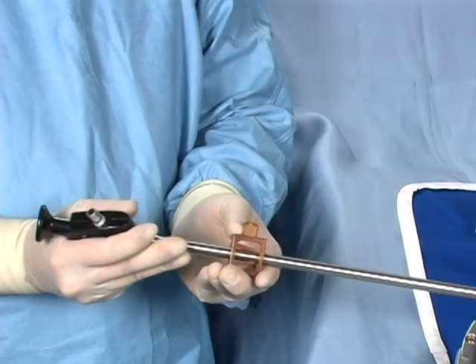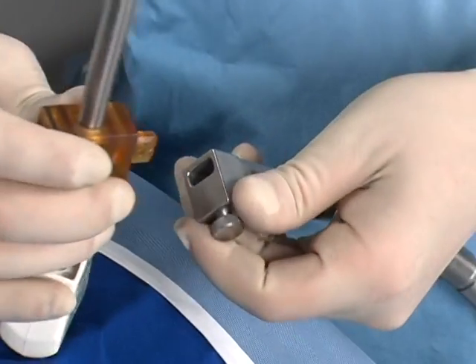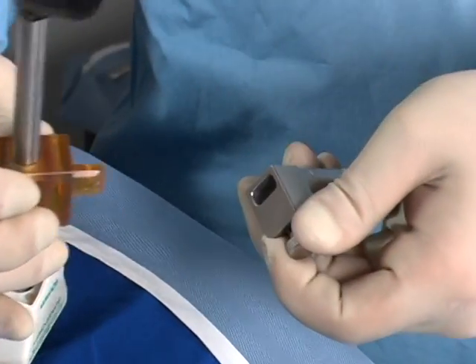Slide the scope clip onto the laparoscope. Snap the scope clip into the scope holder's arm. You can disengage the scope from the arm by drawing back on the knurled knob.